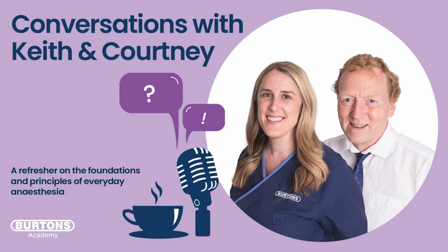So we are taught that there are different phases within our waveform, and I know we can't exactly draw or show people a waveform while we talk about it, but if we had to walk through the different phases, does the waveform begin at 0 for you, which is inspiration, or does it begin at phase 1, which is when we start to expire, or do you think it's not as black and white as inspiring and expiring up and down on the waveform?